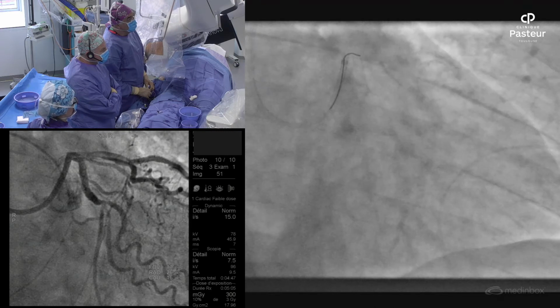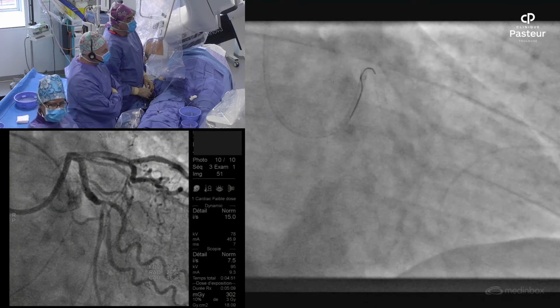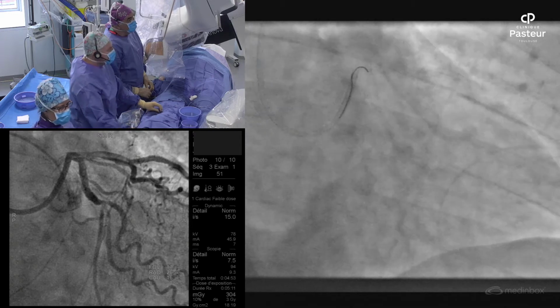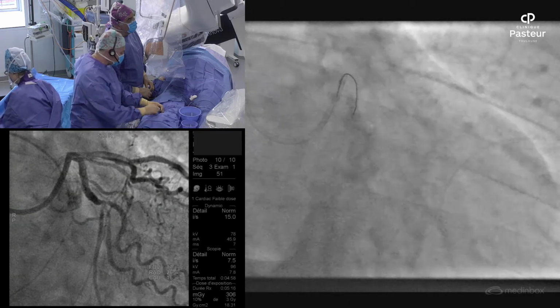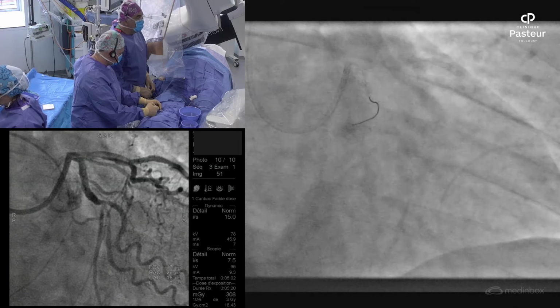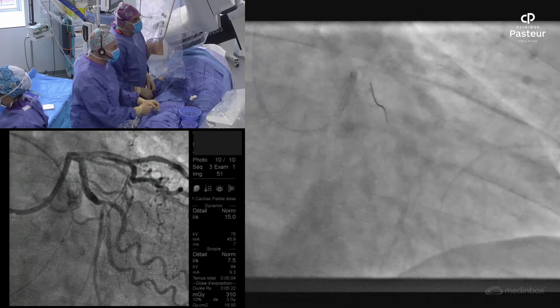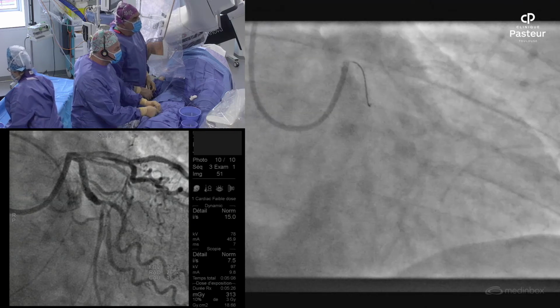Not easy, because the left stent is at the ostium, and the length is short. A colleague asked you to show what type of tip you put at the curve of the wire. It's not an aggressive tip. I will say 40 to 45 degrees angle. Quite a short tip.